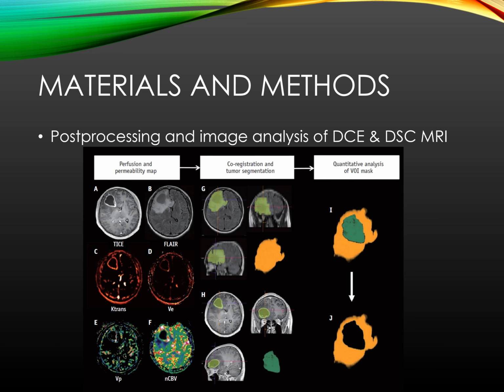The reviewers meticulously defined the volume of interest, VOI, for FLAIR, consisting of the contrast-enhancing portion, necrotic cystic regions, and non-enhancing T2 high signal intensity lesions in each slice. Yellow color VOI. The VOI for contrast-enhanced T1 weighted image covering the contrast-enhancing areas and necrotic cystic regions was also drawn manually using the same method described above.